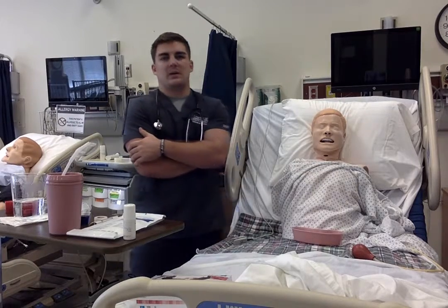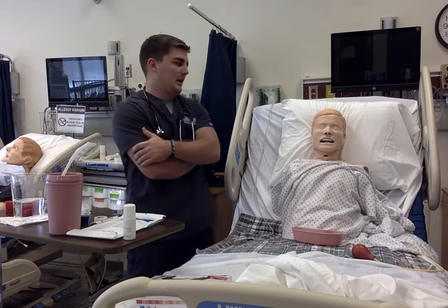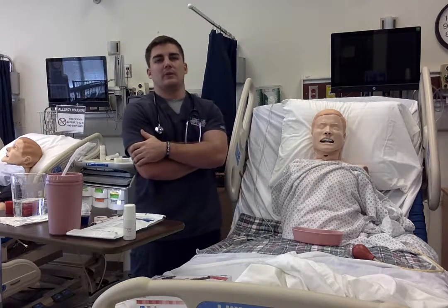I'm Ryan Wood. This is my NG tube insertion, medication administration, and NG tube removal video.